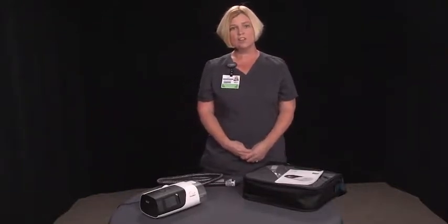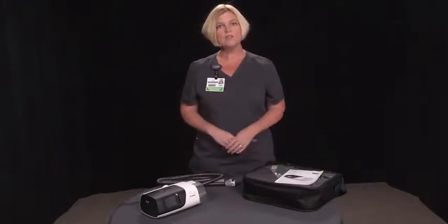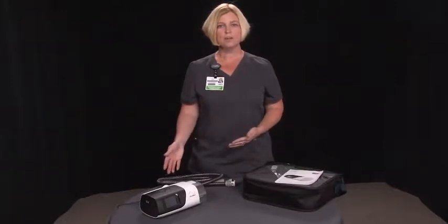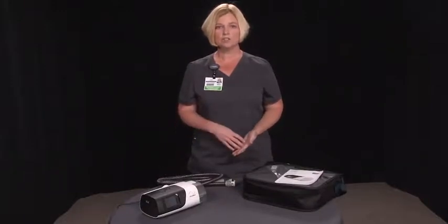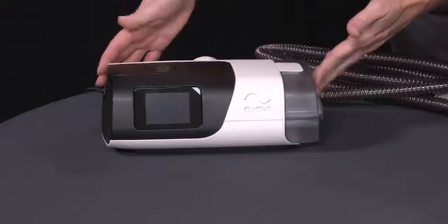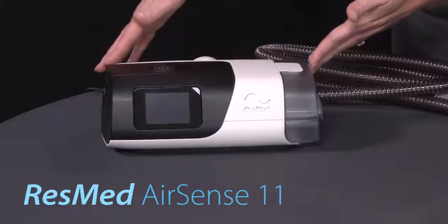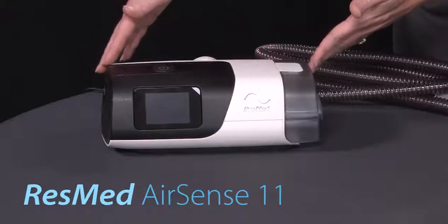To get started, I've got all of the pieces that you would have for your equipment laid out here. I'm going to start with the basics of showing you how to plug it in and how to connect your tubing. This is the ResMed Airsense 11 unit. It's the newest unit in the ResMed line of CPAP equipment.